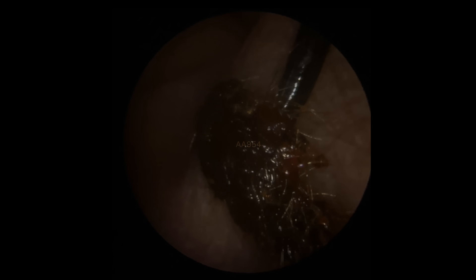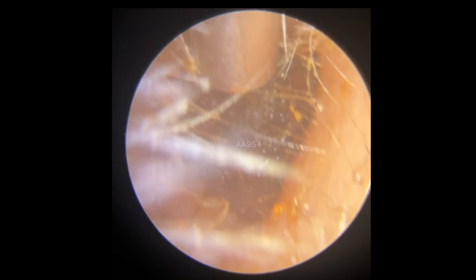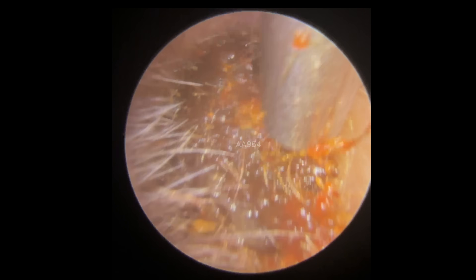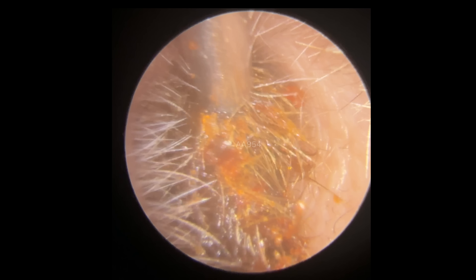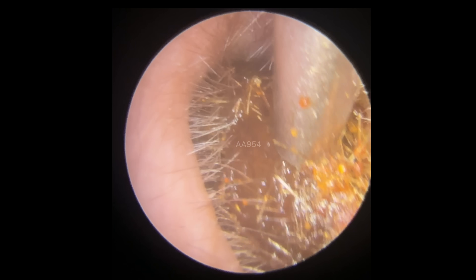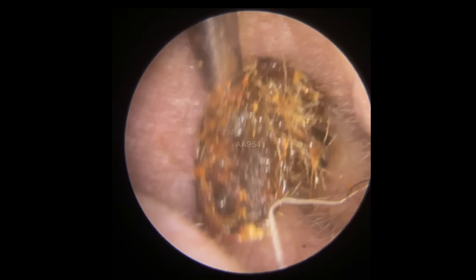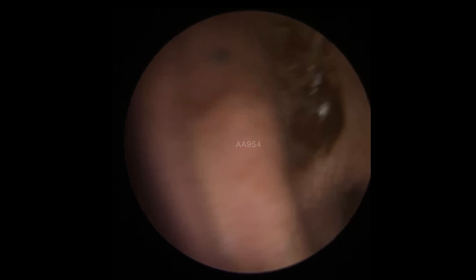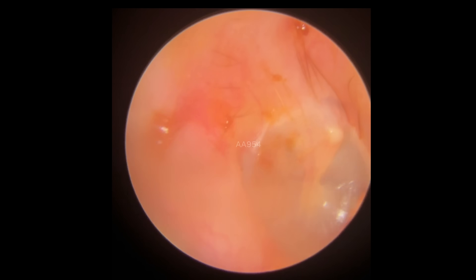It's a pretty chunky old plug that's come away, but when you look beyond you can see there's still a lot of wax sitting further in — it goes a fair way. It looks like a little tiny porcupine in there, a little hedgehog — lots of little hairs jutting out in different directions. I've switched back to the standard size suction tube rather than carry on with the Jobson horn because it's a little bit deeper, and it's always safer to bring these plugs forwards. This is the second half of that plug — massive. There's the eardrum looking lovely and healthy.